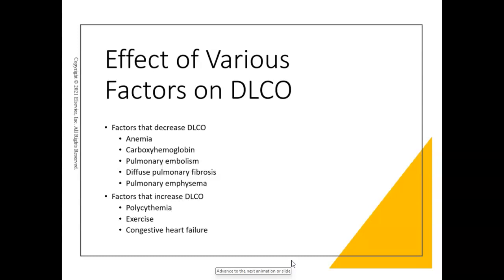We use carbon monoxide to measure my diffusing capacity. So that's what this stands for. DLCO stands for diffusing capacity of the lung for carbon monoxide.